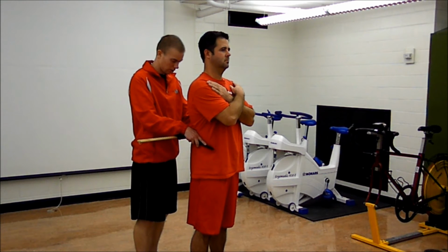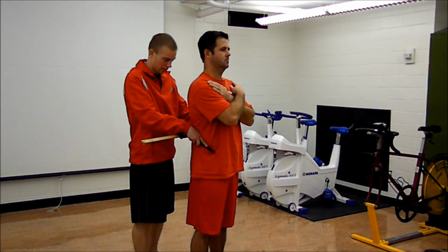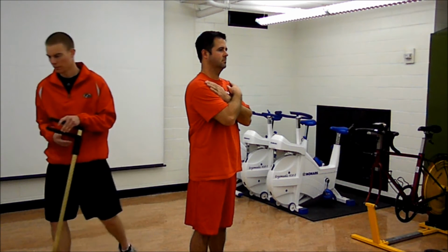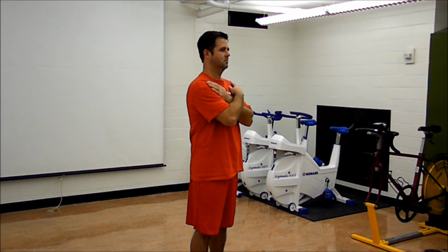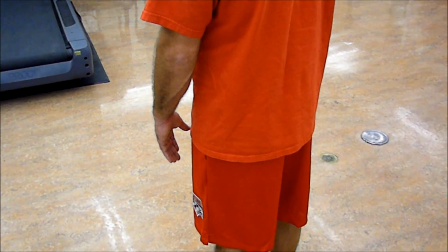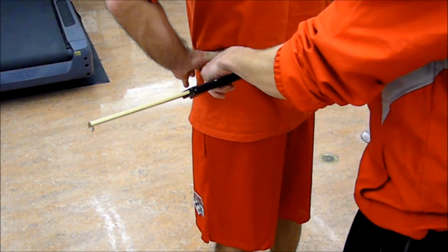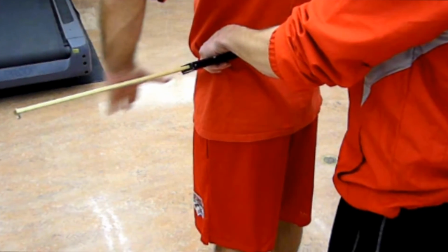The angle of the caliper blades should be at a 45-degree angle downward while the technician is standing behind the participant. The caliper blades should be applied at the maximal width of the iliac crests. Ensure that you're on the iliac crests and not above them, as the value will have significantly increased error.